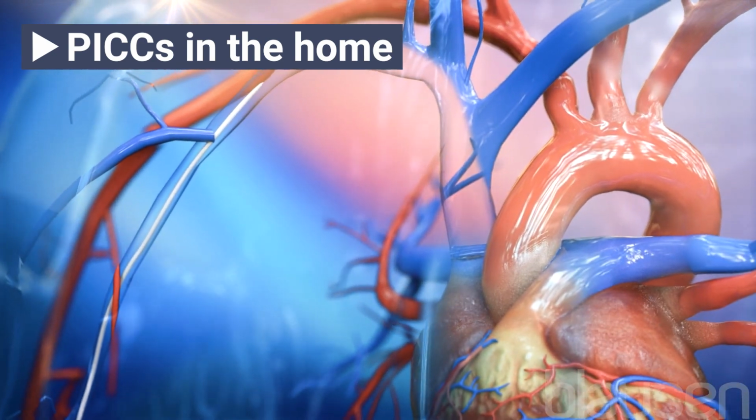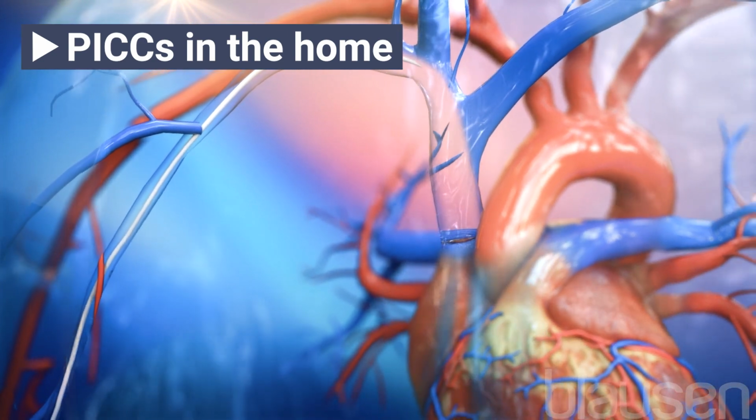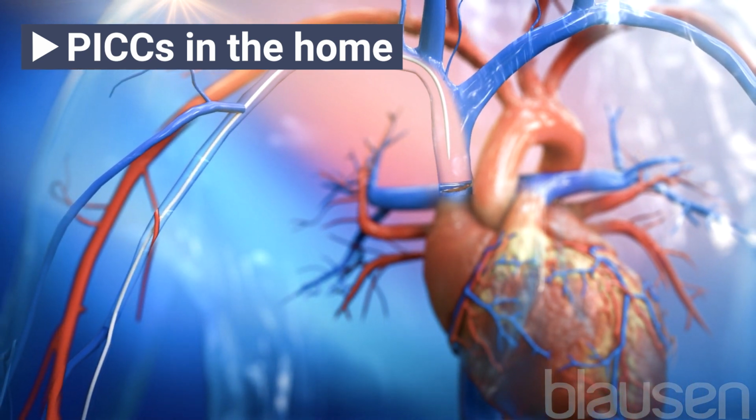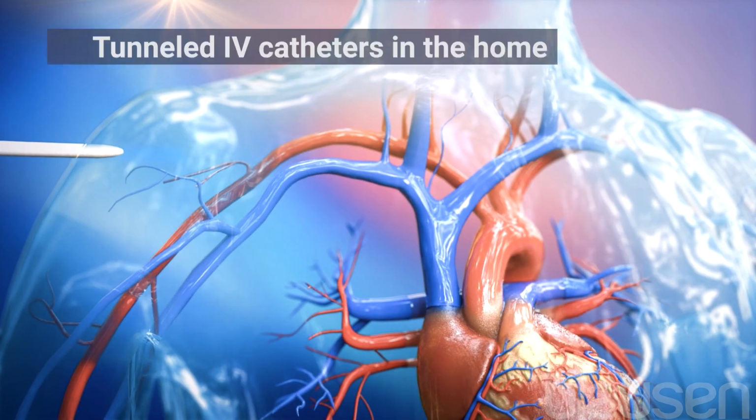PICCs can be placed in a hospital room, surgery, interventional radiology suite, clinic, or even a home. PICCs can be up to 24 inches long, but only a few inches of the PICC are outside the skin. PICCs can stay in place for many months. Most medications can be put into a PICC. Many patients who need IVs at home have PICCs.